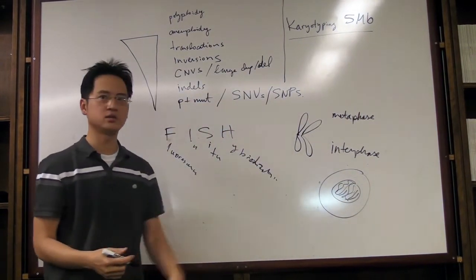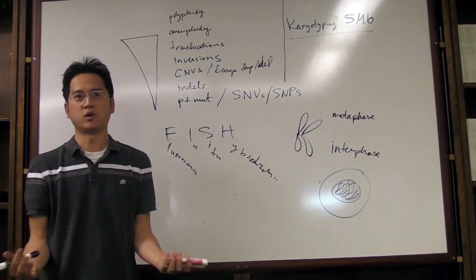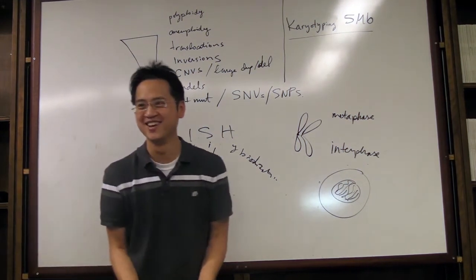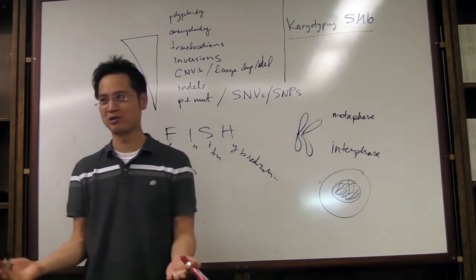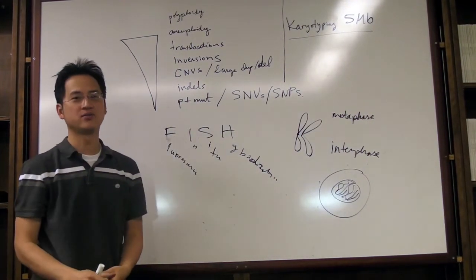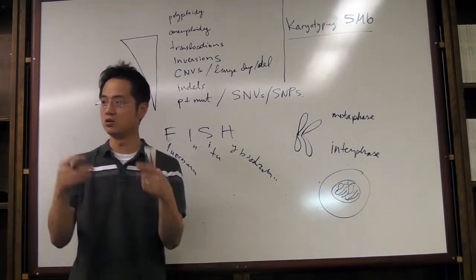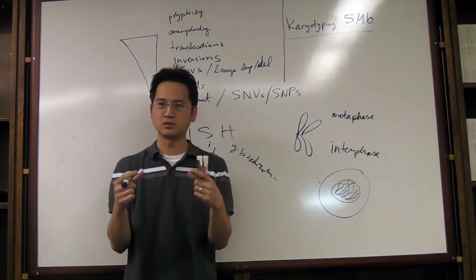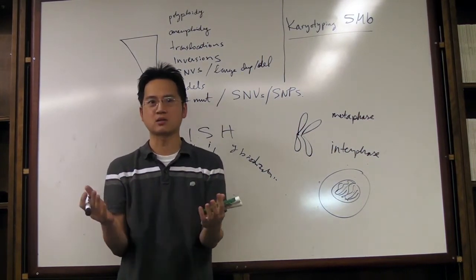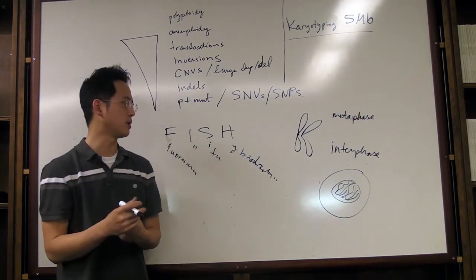Why can't we do Metaphase FISH in our lab? Fixed tissue. We only work with fixed tissue. And I would shoot myself if we were to do Metaphase FISH, because that means we have to open up a cell culture lab, collect fresh specimen, do all of the business of karyotyping, which is very, very tough work to do. And with Interphase FISH, you can use dead cells, because what did I tell you? Most tissues that you acquire from the body are going to be in interphase, in their resting state. Even in cancers, you only find a minor fraction of them undergoing active division and mitosis.